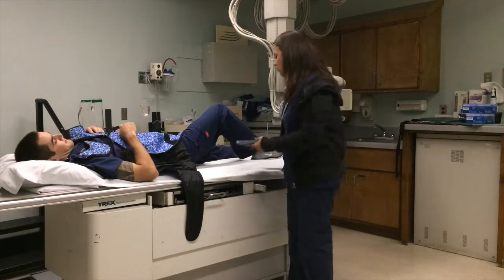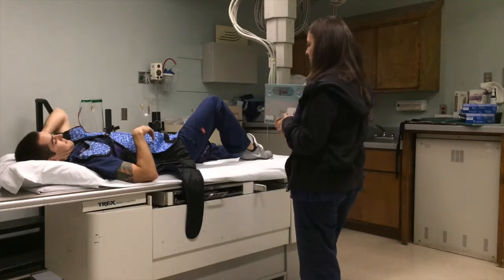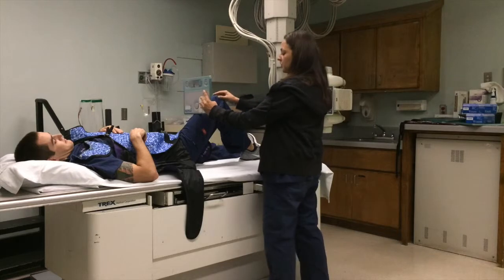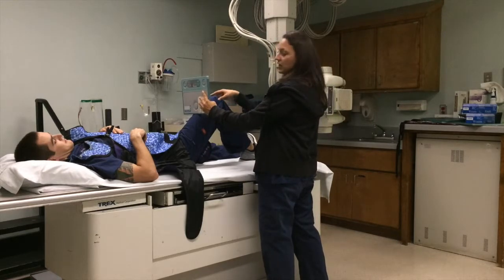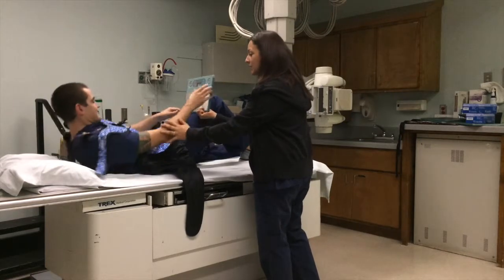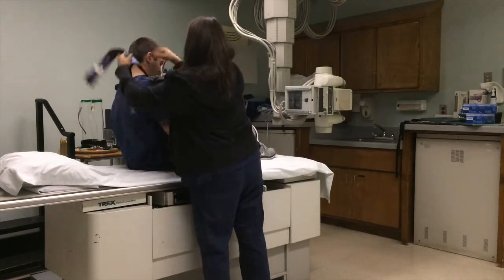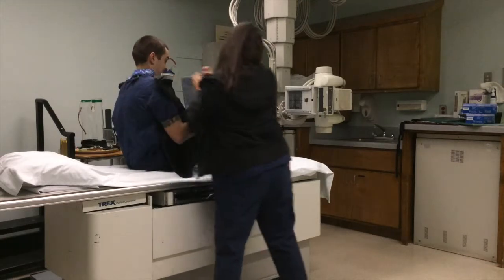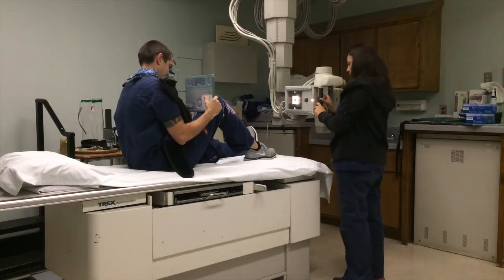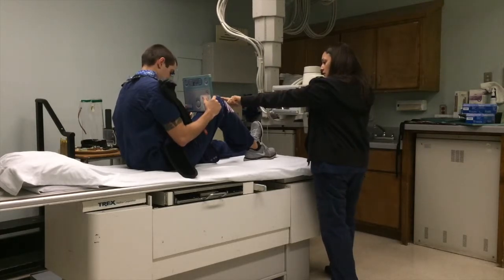Okay, so for this view, I'm going to go ahead and bend his knee about 60 degrees. I'm going to take my IR and place it behind his kneecap, because what I'm doing is centering the central ray perpendicular between the patellofemoral joint space. We're trying to take the patella and make it free of any superimposition. So if you don't mind leaning up and just holding this here. Is that okay? There we go. That actually looks pretty good. There's 40. I'm going to enter just below the apex.